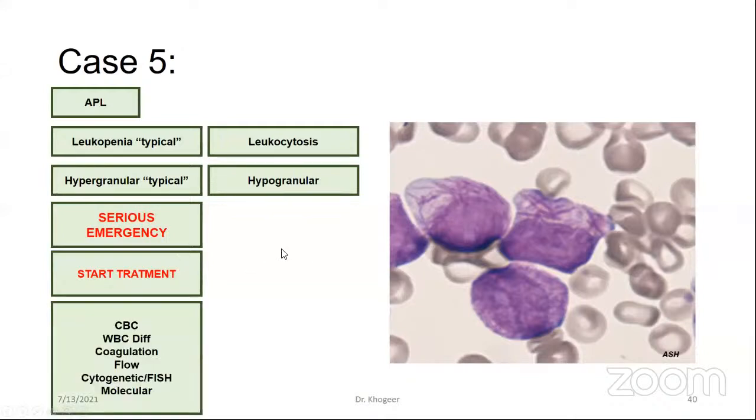In addition to the CBC with differential and review of the peripheral blood smear, all patients with a presumptive APL diagnosis must undergo an urgent laboratory evaluation.